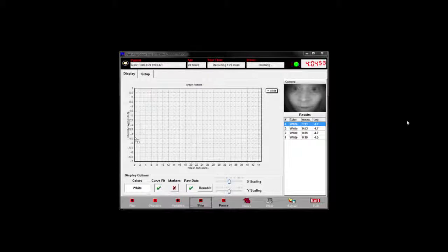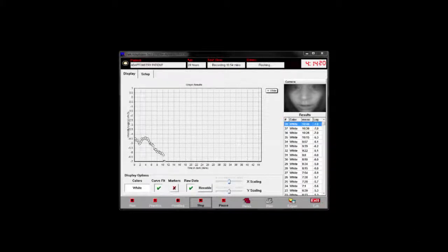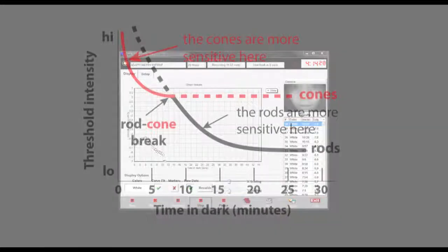The timer at the top of the screen shows the running duration of the test. After approximately 10 minutes in the dark, cones are maximally sensitive and will level off while the rod sensitivity continues to improve. This shows up as a double curve in the adaptation graph.